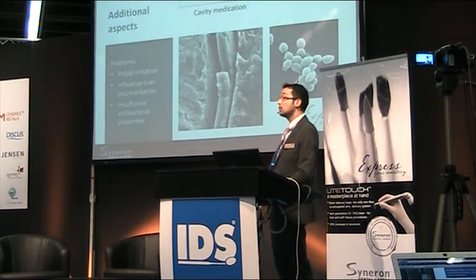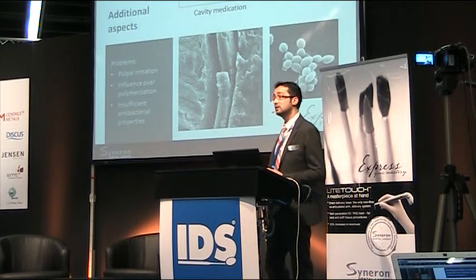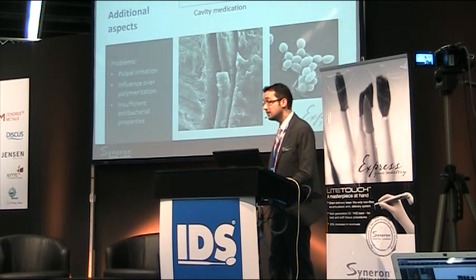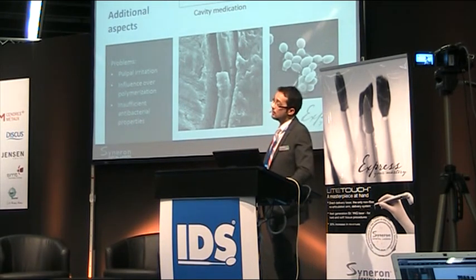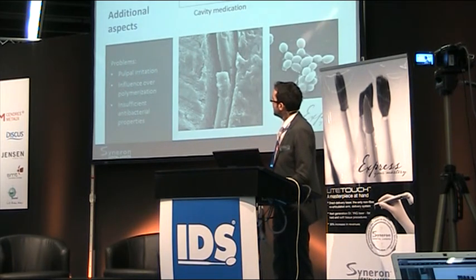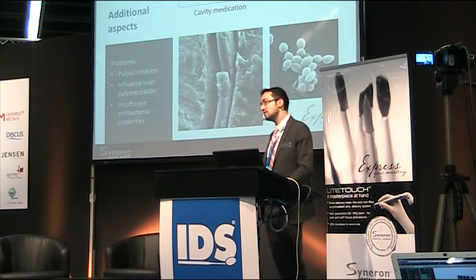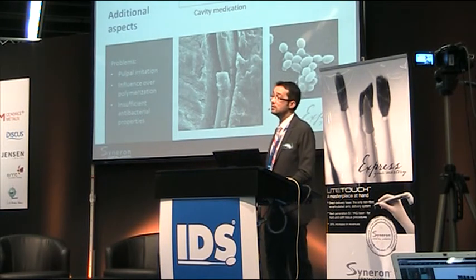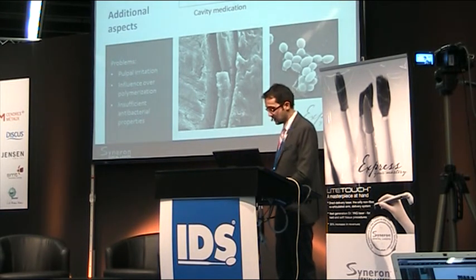This is important because due to this antibacterial activity of the laser, we can avoid any additional medication of the prepared cavity. Because you know that the additional medication can provide pulpal irritation, influence the polymerization, and also possess insufficient antibacterial effectiveness.